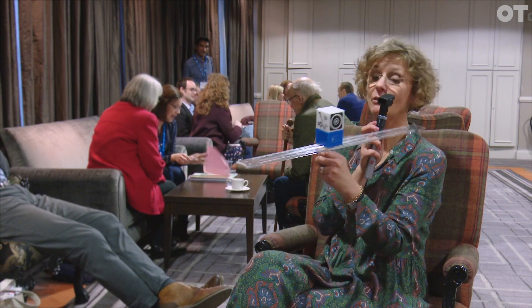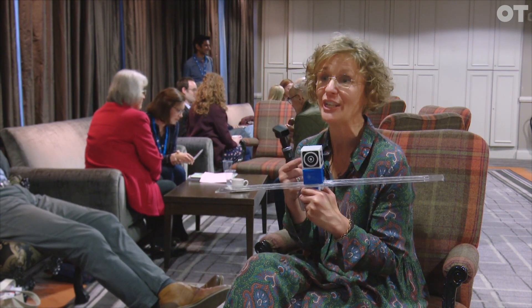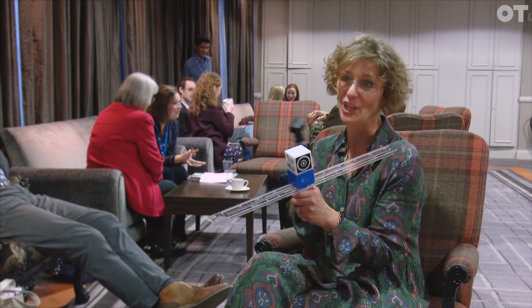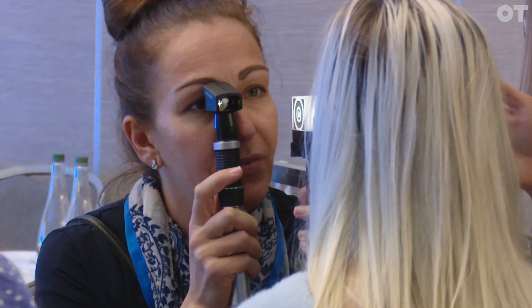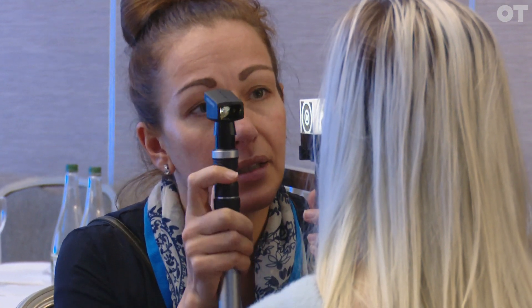If I have to move back by this amount, I can look down and say that's within the normal limit - that's okay. If I'm moving way back here, that's not within the normal limit; they've got a reduced level of accommodation. But always check that they're still looking at the target - that's really important. If you get a with-movement and you move back and back and back, it may be that they're looking at the light. This is called Nott retinoscopy, and the reason we need a tool like the Ulster-Cardiff cube is it gives us normative data, so we're able to make a measurement and compare against normative data to say whether that measurement was normal or not.